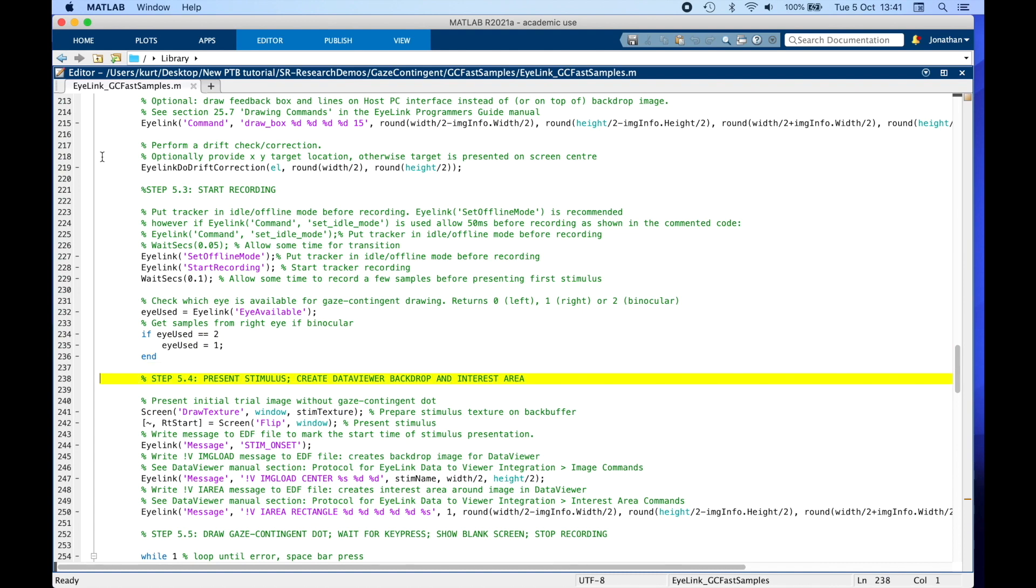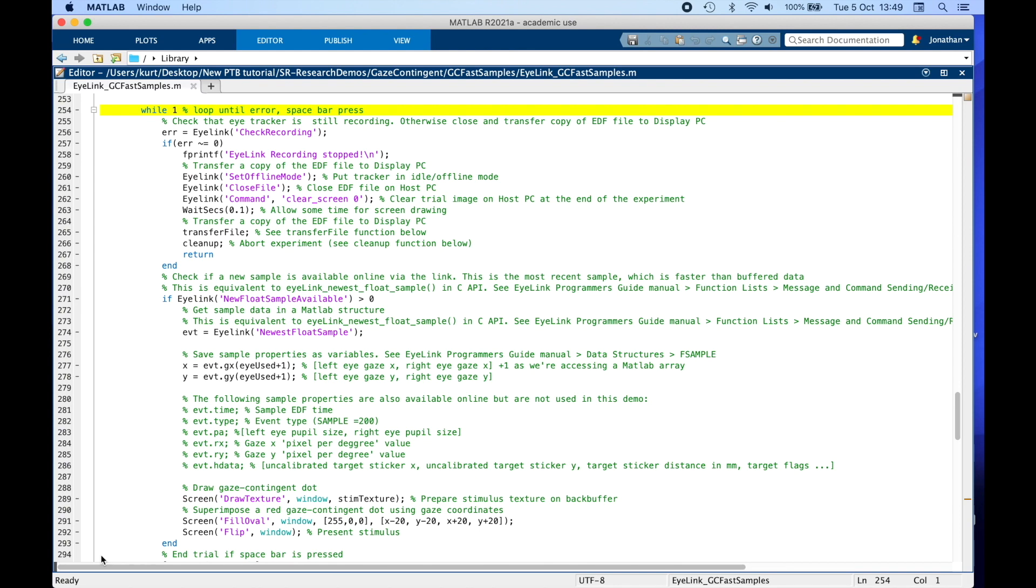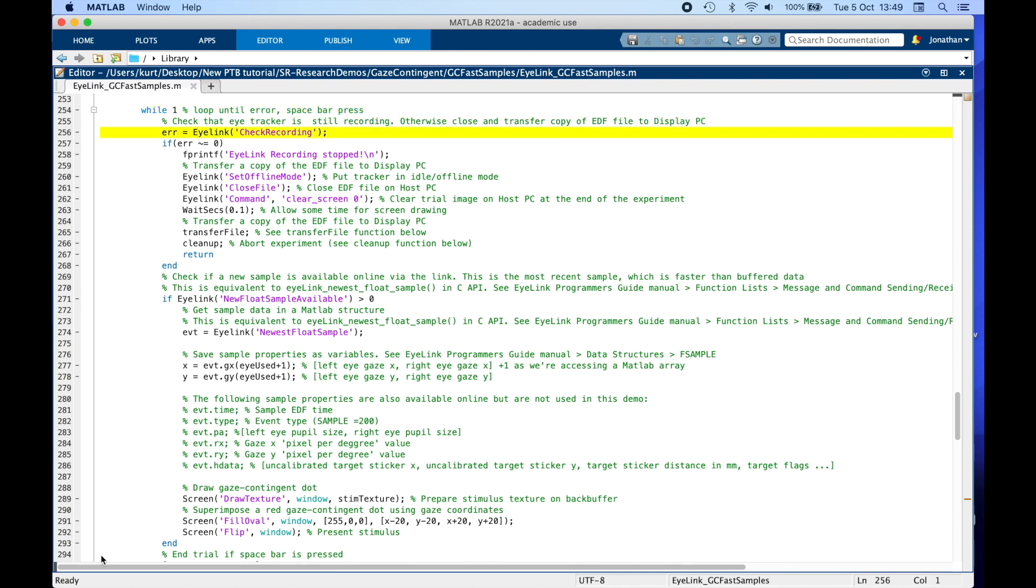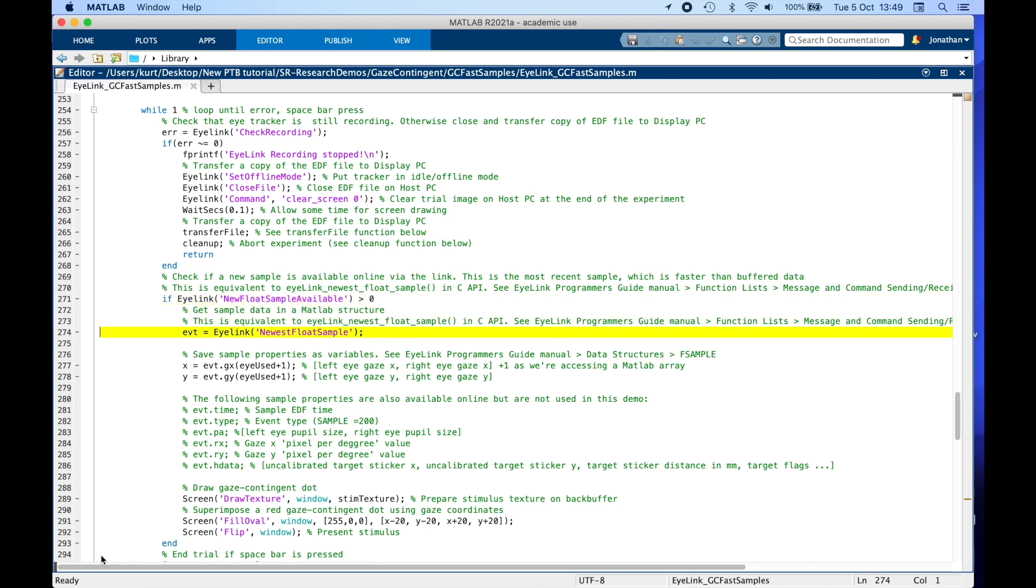After the initial stimulus presentation, we start a while loop, check that the eye tracker is still recording, then check if a new sample is available online. So if EyeLink_NewFloatSampleAvailable returns a value bigger than 0, we call EyeLink_NewestFloatSample, which returns a structure with sample data.